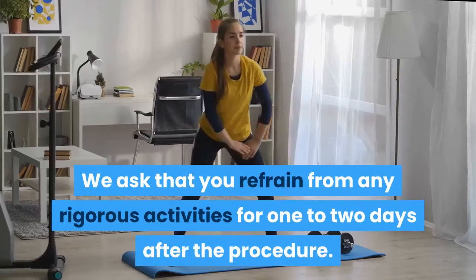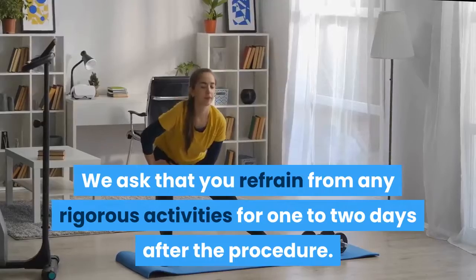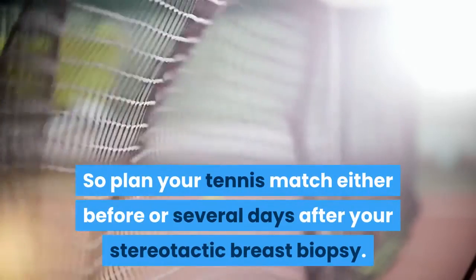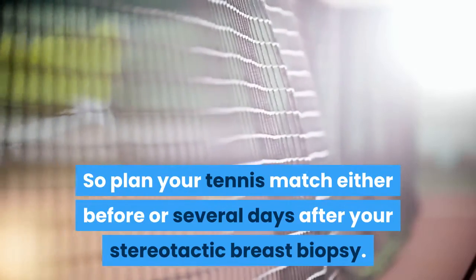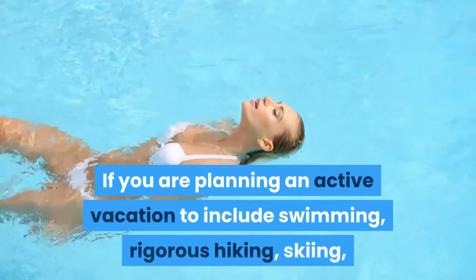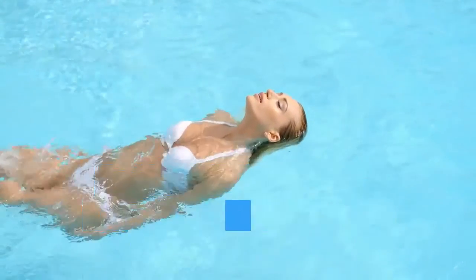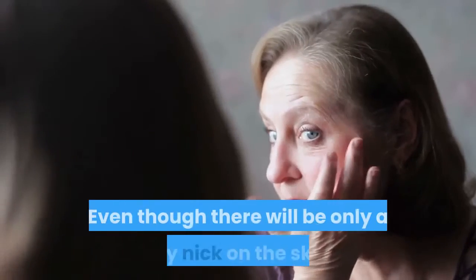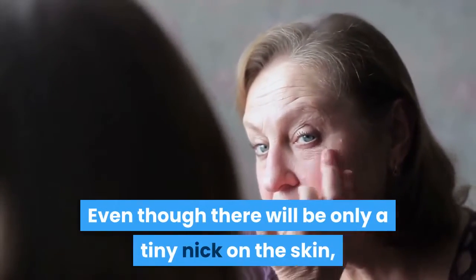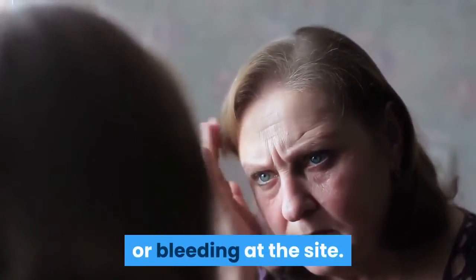We ask that you refrain from any rigorous activities for 1 to 2 days after the procedure. So plan your tennis match either before or several days after your stereotactic breast biopsy. If you are planning an active vacation to include swimming, rigorous hiking, skiing, you may want to postpone the biopsy until you return. Even though there will be only a tiny nick on the skin, we want to minimize the chance of soreness, infection, or bleeding at the site.